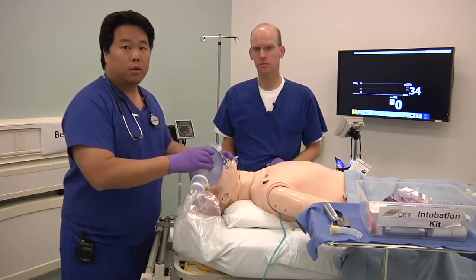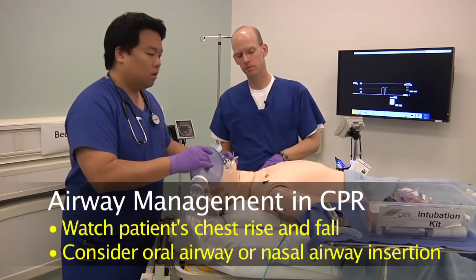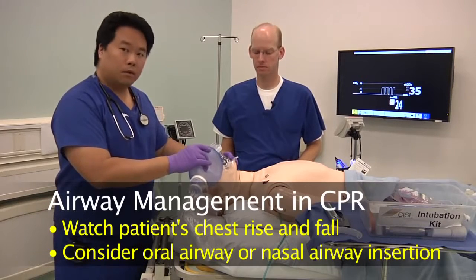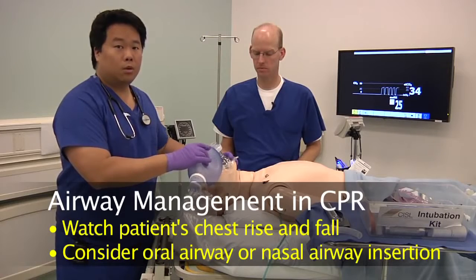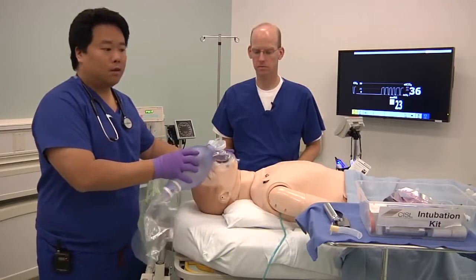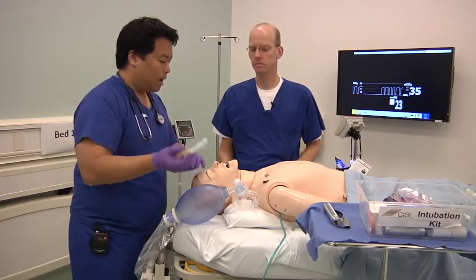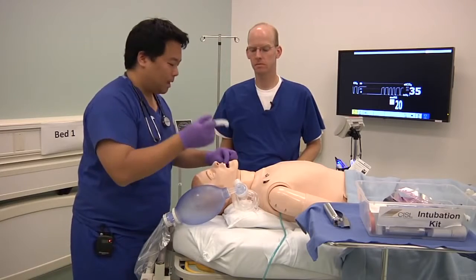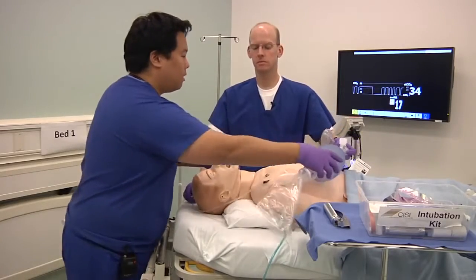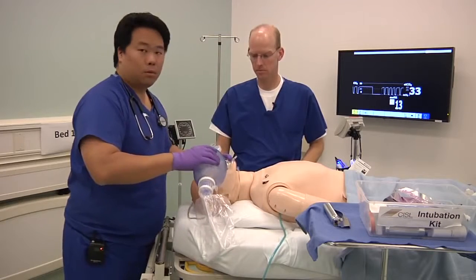And what you want to do is watch the patient's chest rise and fall with each breath so that you are confirming that you can ventilate the patient. If you have difficulty, there are things that you can do to help facilitate mask ventilation of a patient. One of the most common things is insertion of an oral airway. You can take an oral airway here, and you can insert it into the patient's mouth upside down, and then turn it around properly, and then go ahead and try mask ventilation again, and see if that can help you.